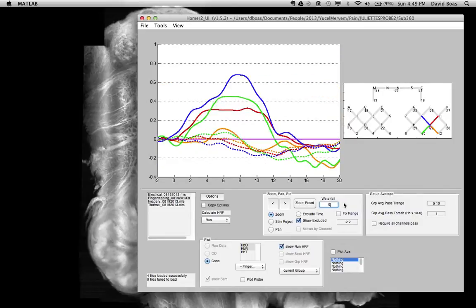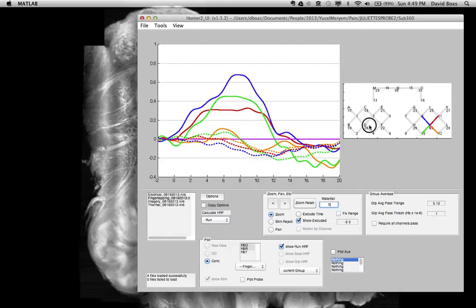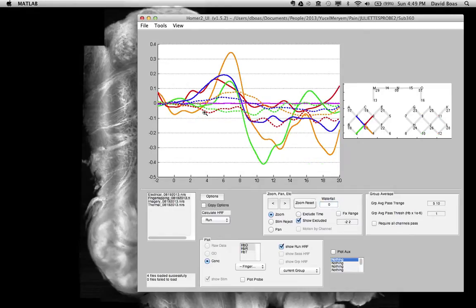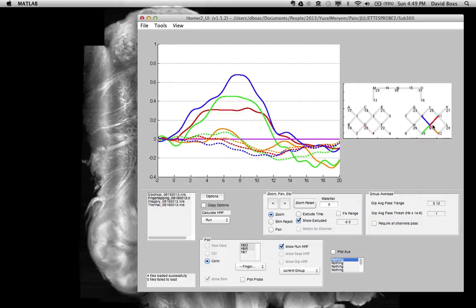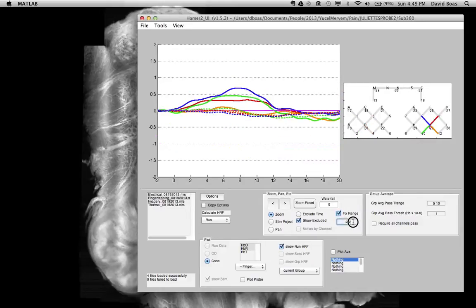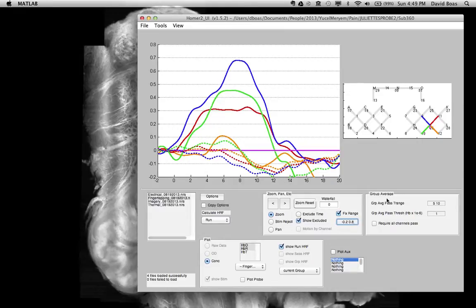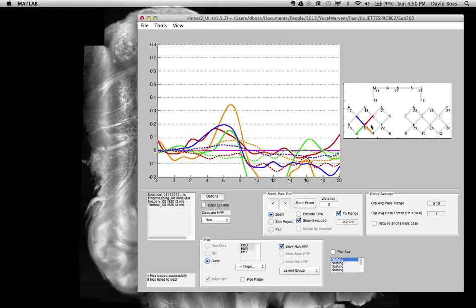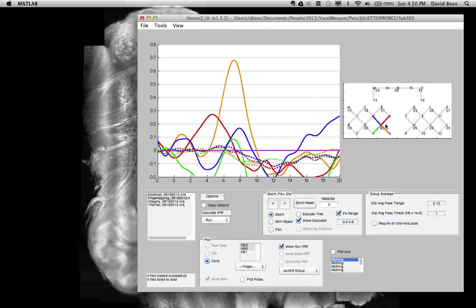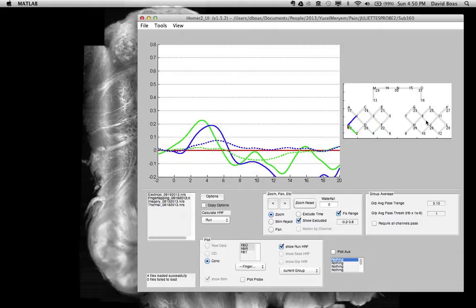Another useful feature is the fixed data range. You may have noticed when you select different channels, it auto-scales. But what if you want to fix the scale as you select different channels of data? You can fix the range and specify it here: minus 0.2 to 1. Now this is minus 0.2 to 0.8. When we go around to different channels, it's going to keep that scale, which makes it easy to visualize the relative amplitude of different channels.